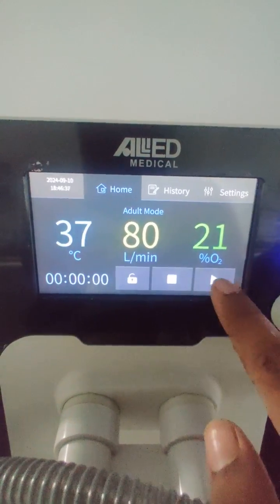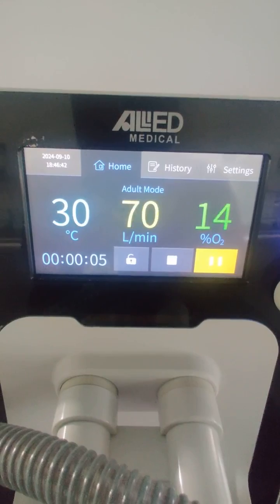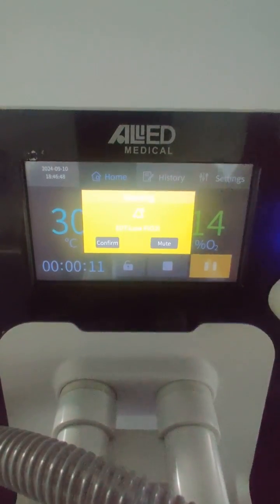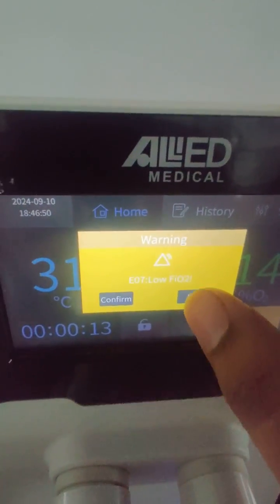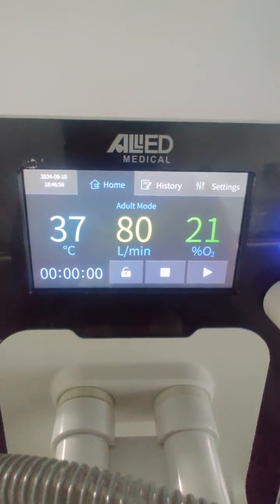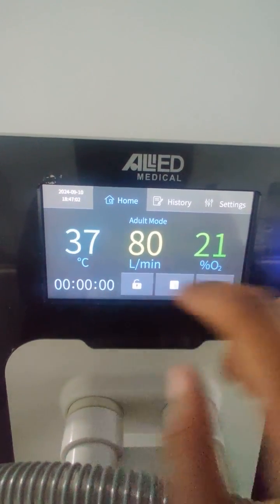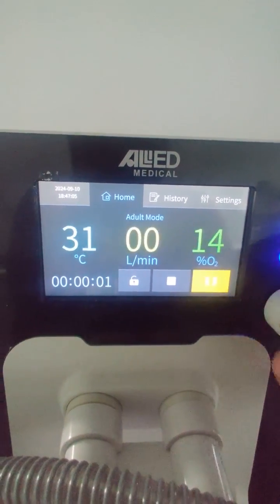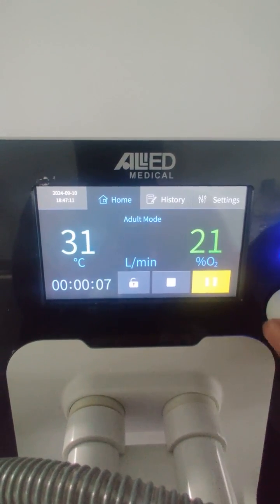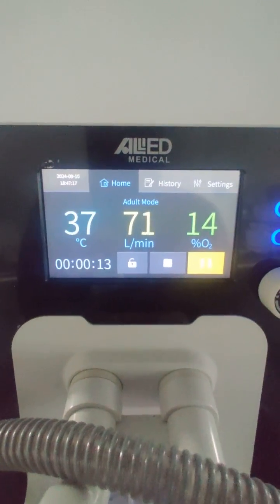After starting therapy, the parameters shown on the screen are the measured parameters. Right now it is showing 14% oxygen because the oxygen source has not been connected, and it gives a low oxygen alarm. In standby mode you can change the settable parameters, and during therapy you can also adjust parameters by selecting them and using the knob. Pressing the encoder knob confirms the settings.